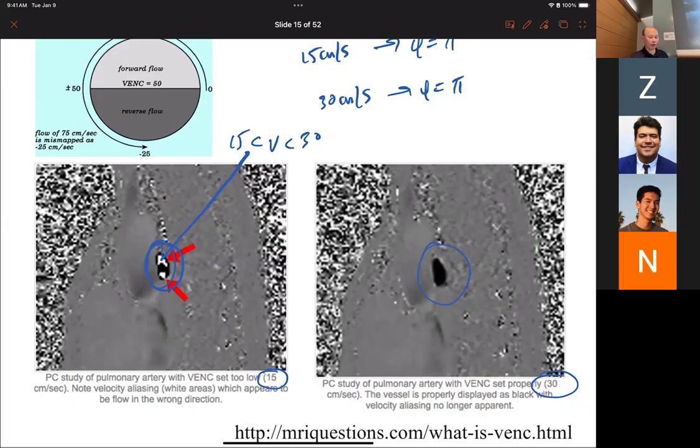That's why radiology is an interesting area of medicine, because the radiologists have to know enough about the physics of what's going on to make sure that something is not an artifact and is actually reflecting your physiology, and also to make sure that the settings are set up so that they don't get fooled by physiology. So even setting this physics parameter, they have to have some knowledge of what the expected velocities are that they're going to measure.